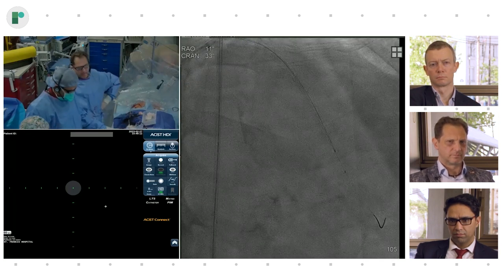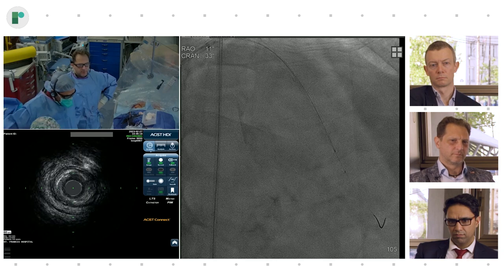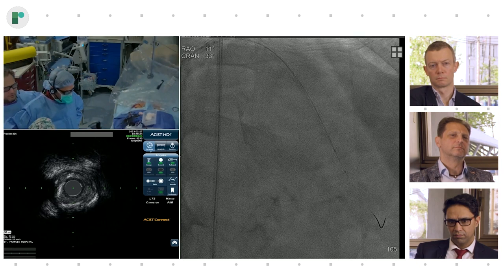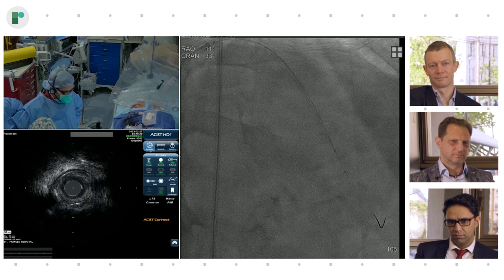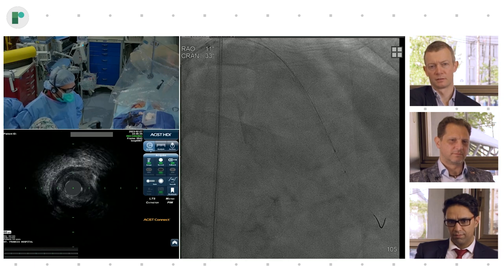That's it. I'm going to click here and go live. And I'm going to start. So that's also nice, right? That the pullback speed is adjustable depending on the situation. Yeah. So the distal diffuse disease. Yeah. Now you clearly see the vessel, right? Yep. Right.